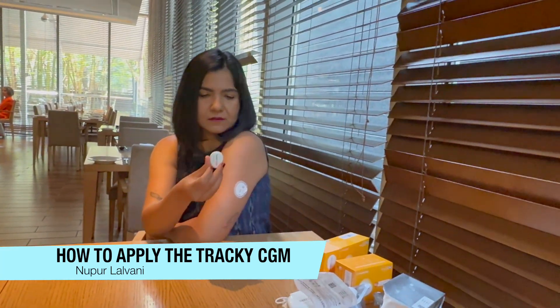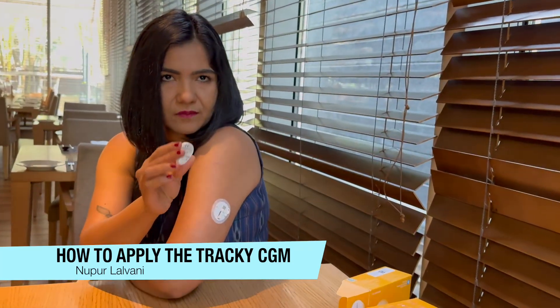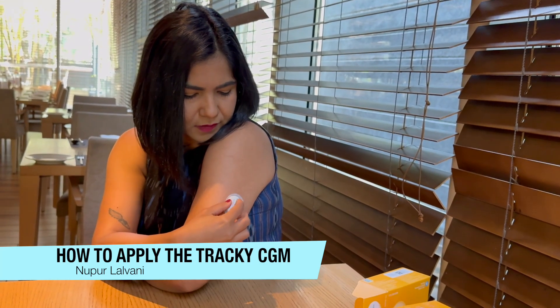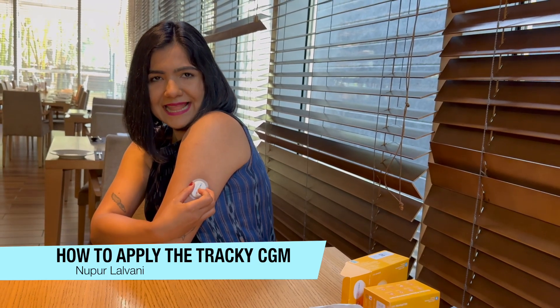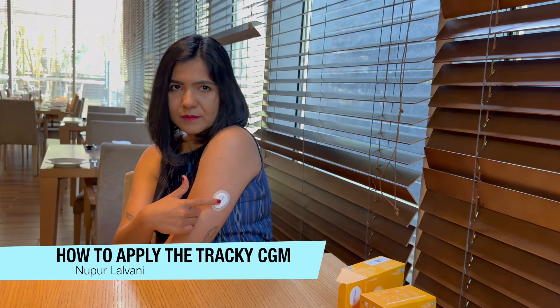Then you take your transmitter and you need to match it onto the gap of the sensor. Plug it in and then slide it and lock it. That's it — it only takes a few minutes and my sensor is now ready. I can see it on my arm. What you see on top of my arm is actually the transmitter, and the sensor is the thing below it that is stuck to my arm.